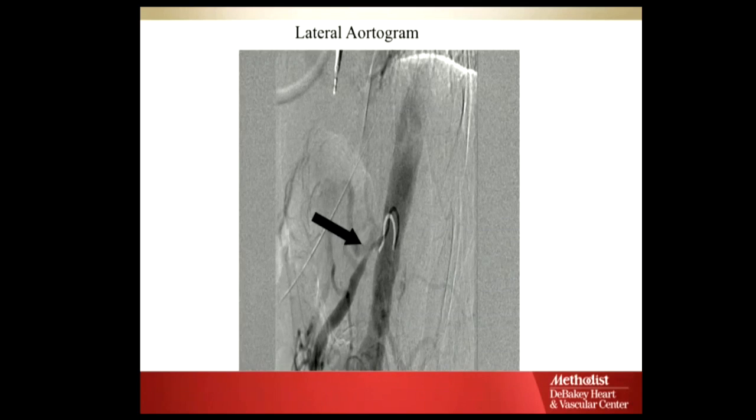Yeah, what's been done is you probably got what's called an image overlay. You take the last image, overlay it, and then you put a live image on top of it. So one's a virtual catheter. It was there before we started manipulating it, and this is probably the real catheter because it's engaged in the origin of the SMA.